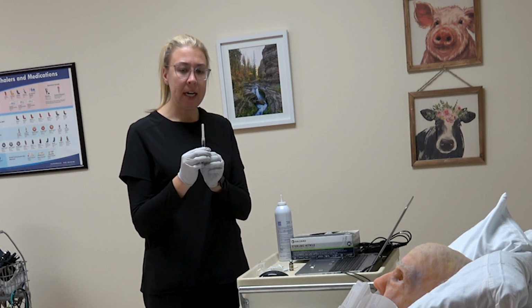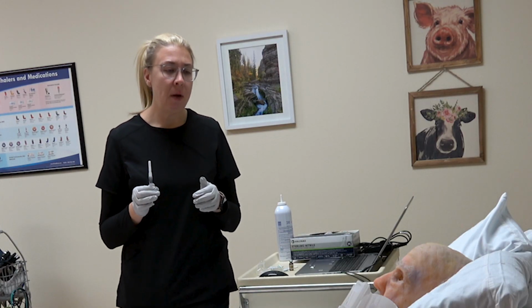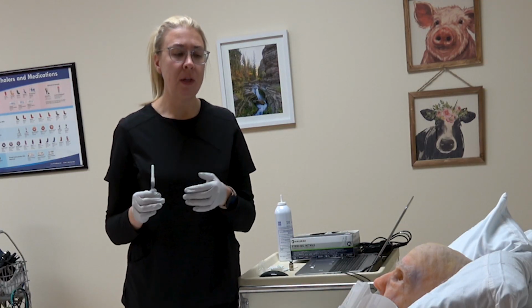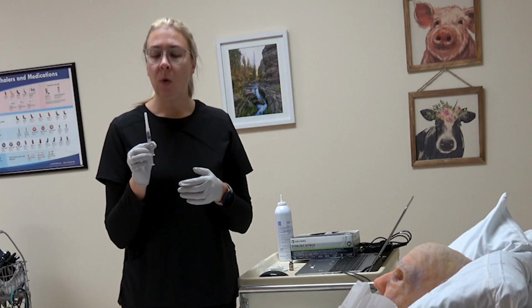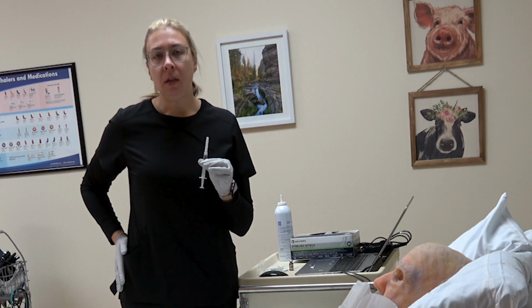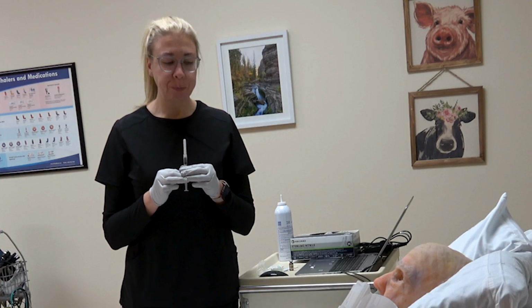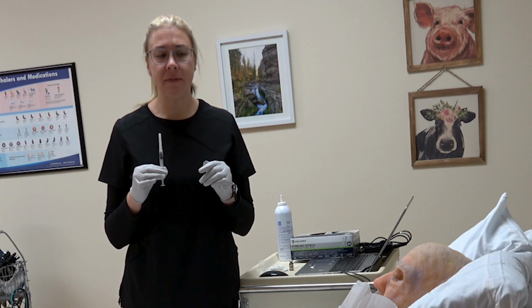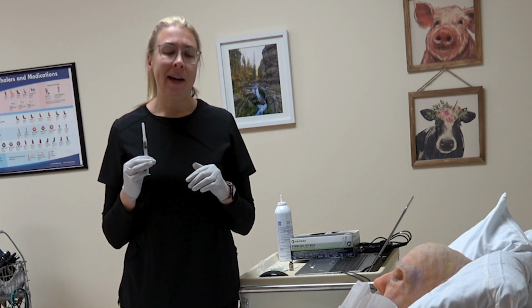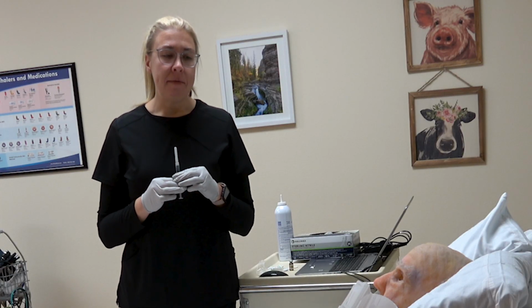I'm going to go over and I'm going to come around to the side. I'm going to select a muscle that I want to use. When you're looking for a muscle, we can use deltoid or ventrogluteal. A deltoid can hold up to 1 milliliter of medication. Ventrogluteal is a larger muscle, so you can do up to 3 milliliters of medication in the ventrogluteal. You're going to look at the integrity and the size of the muscle. We're going to inspect the muscle for any redness, swelling, hardness, tenderness, and then we'll select our site from there.